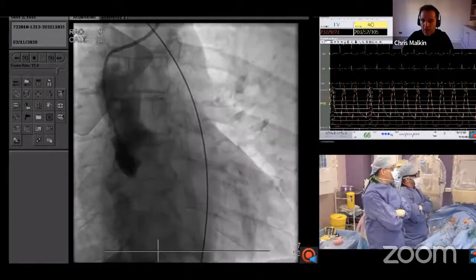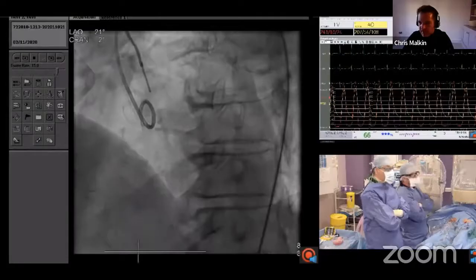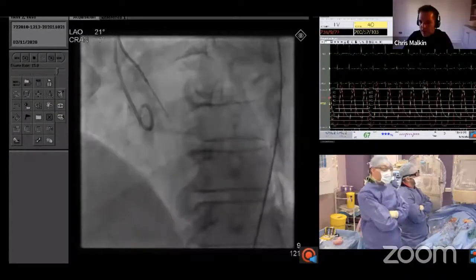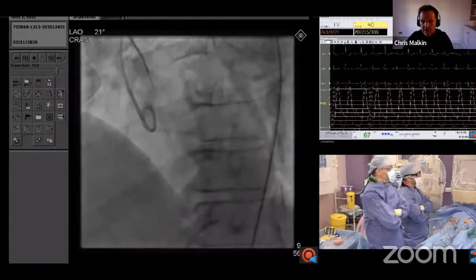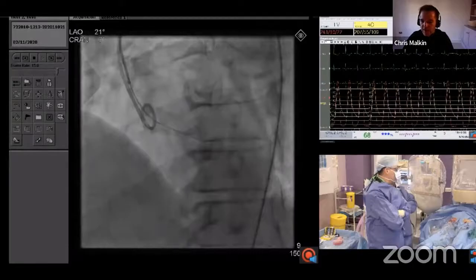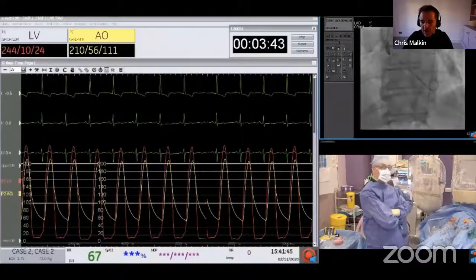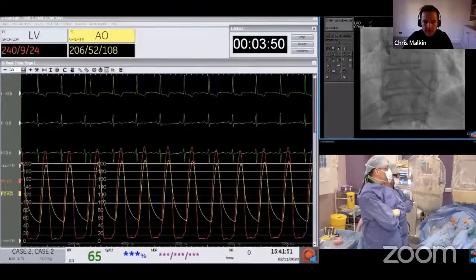The sinuses, as you can see in this aortogram, were reasonably capacious, so we had no concerns about coronary jailing. You can see that the hemodynamics on the right show that she had very significant hypertension. She had a very small LV cavity, so almost a paradoxically low flow physiology with a relatively small invasive gradient, but actually hemodynamically it was having a significant effect on her. She was very symptomatic. And we felt that in this case, a supra-annular valve would be the key for her, giving her the best possible hemodynamic result. In fact, we calculated that an intra-annular balloon expanding valve probably would leave her with a residual gradient and would almost certainly give either moderate or moderate to severe patient prosthetic mismatch.